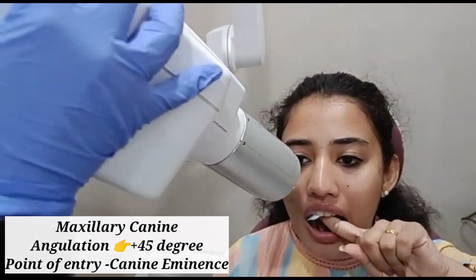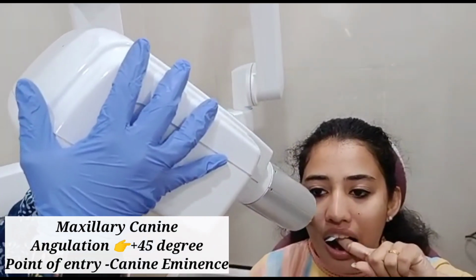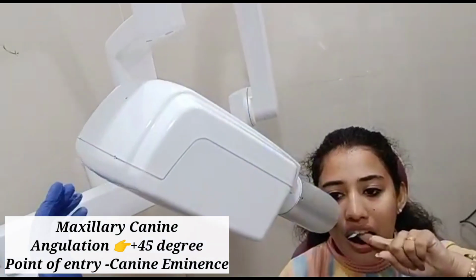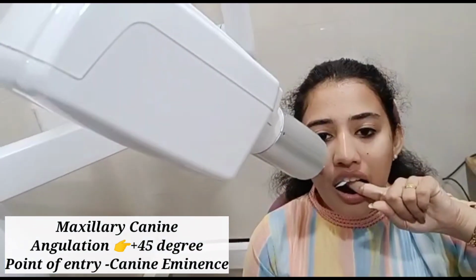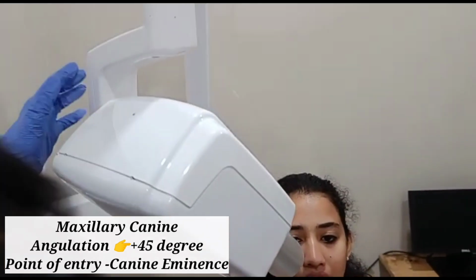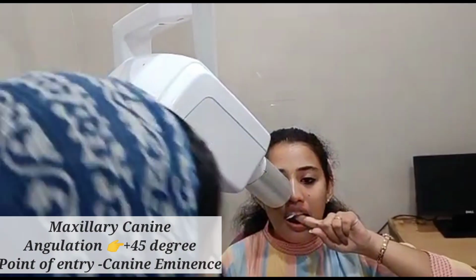And then the point of entry is through the canine eminence, such that it intersects the distal and the inferior borders of the ala of the nose. So this is how we take the maxillary canine projection.